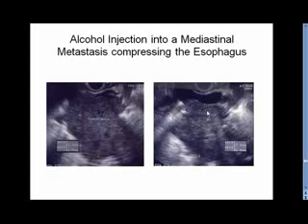After alcohol injection, like a week later, there is a sliver of pleural fluid separating the tumor from the esophagus, indicating that the tumor doesn't push that hard anymore. Otherwise you wouldn't see that. And also the dimensions have shrunken to 3.7 by 3.6 centimeters. Clinically, this was associated with a good palliation of the dysphagia.